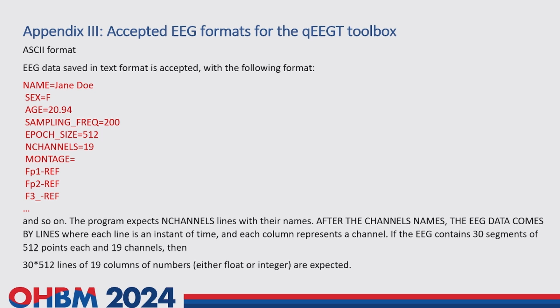Depending on the size of your epoch, the frequency analysis will change because you will not have the same frequency resolution as we have when we created the norms.